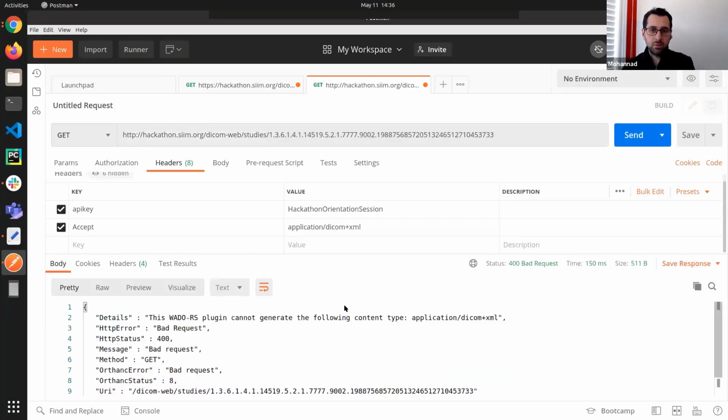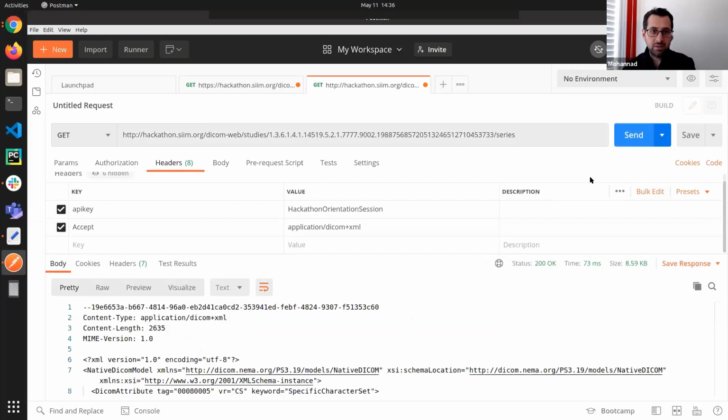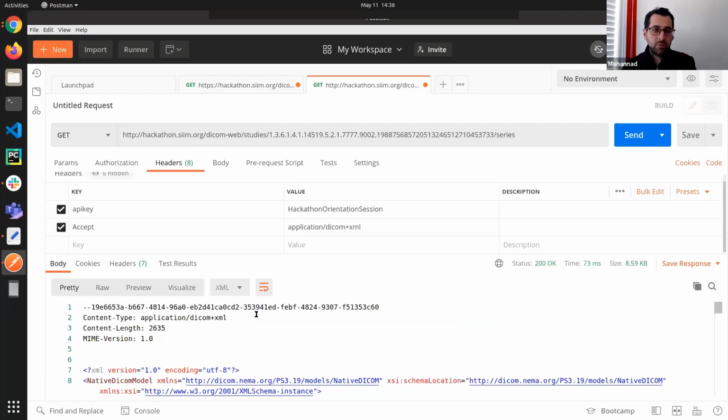Interesting. Oh, my apologies, I need to do series or instances. That's why. So let's say series and send this. Again, I'm going to flip it here. This is now returning the listing of all the series within the study.